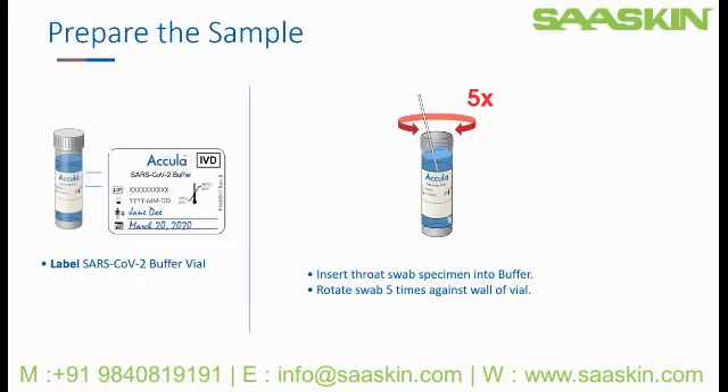Replace the buffer cap. This prepared buffer should be tested immediately, but may be stored at room temperature for up to 24 hours. Further storage conditions are outlined in the product instructions.